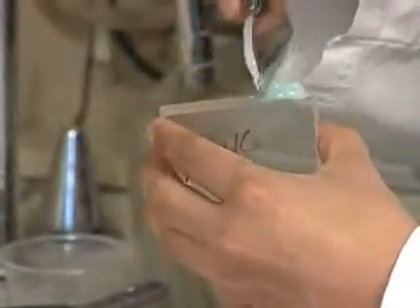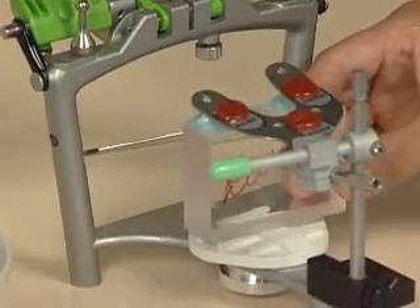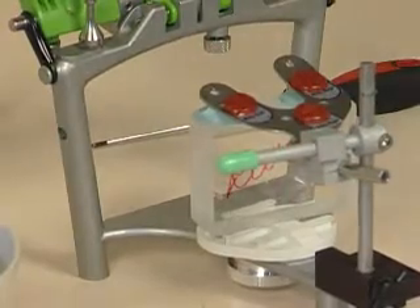The next thing is that you want to support the bite fork. You don't want to put a model on yet — the weight of the model will tend to dislodge the bite fork. So we're going to mix up some quick-set stone and put a couple of little dabs here and slip it underneath like this and let it set. That will support the bite fork.